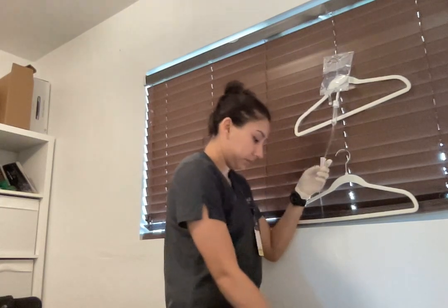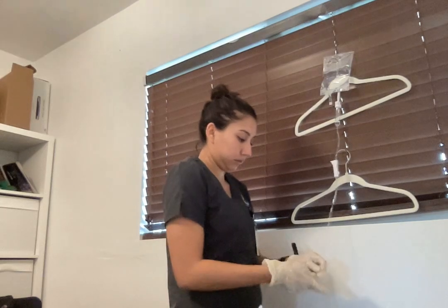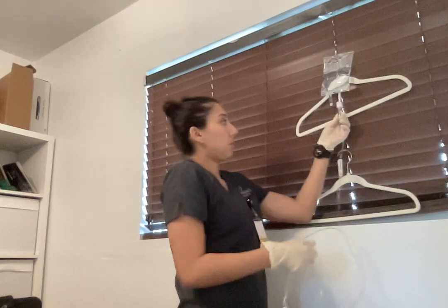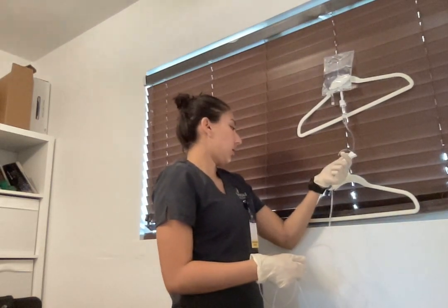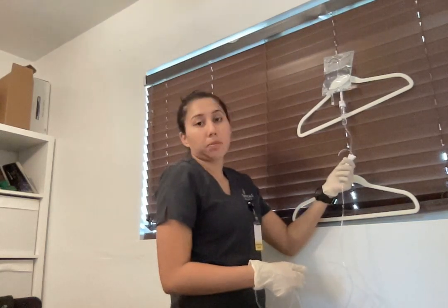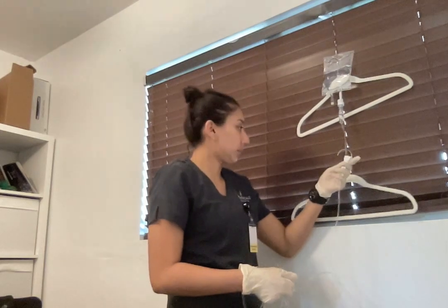Alrighty. And then from here, I will count a minute for the 38 drops to drop into here, since this is our fluid.